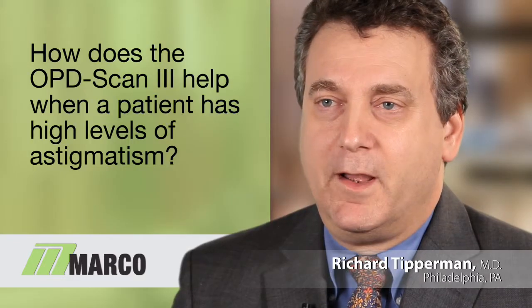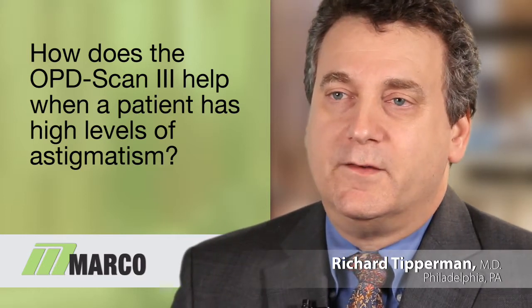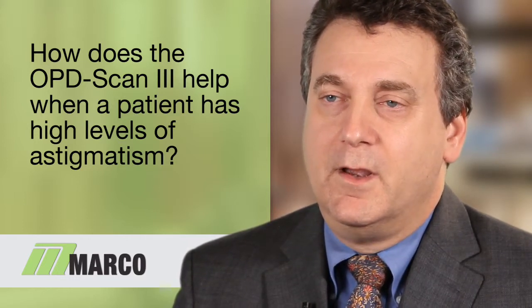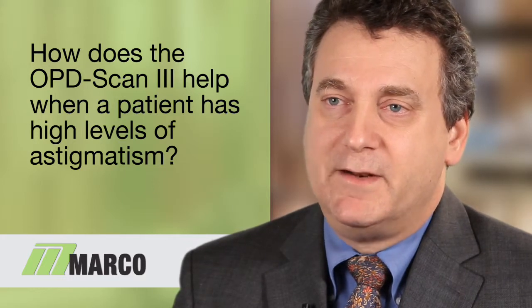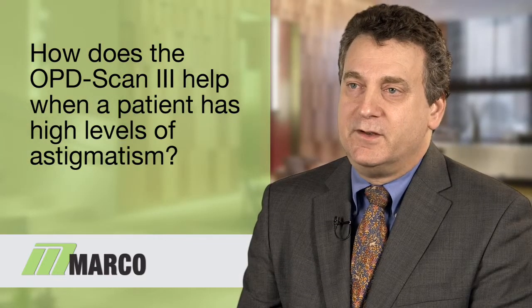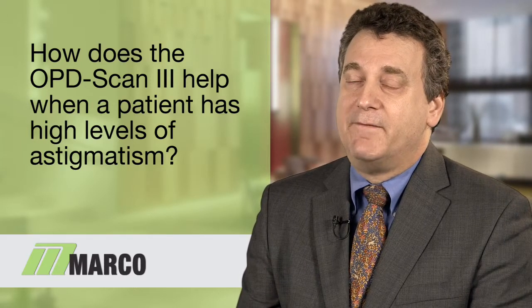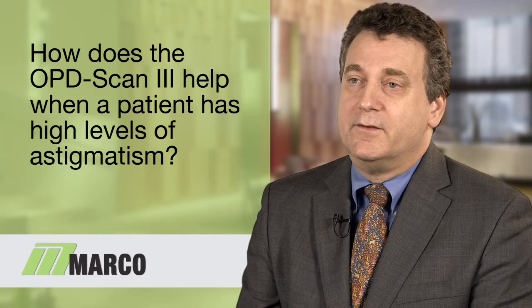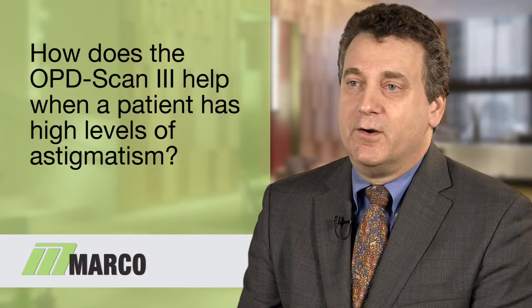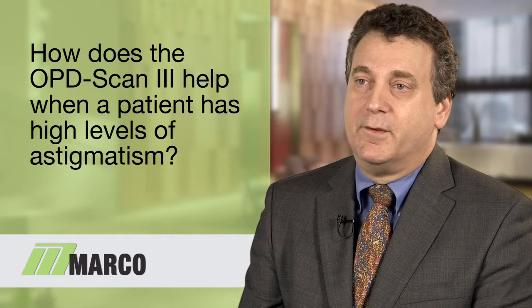The OPD scan can be very helpful when trying to make a decision as to what form of advanced technology lens is best for patients. Some surgeons are comfortable using multifocal lenses in patients with high levels of astigmatism, whereas others want to use toric lenses. And in many patients, they could potentially be a candidate for both. The OPD scan is especially helpful in a patient who's considering a multifocal lens, but then you look and see that they have astigmatism and a fairly high level of higher order aberrations. That's a patient where I'm very comfortable saying, I know you're interested in multifocal technology, but we're probably much better off going ahead with a toric lens. And it allows you to make that recommendation very comfortably for the patient.